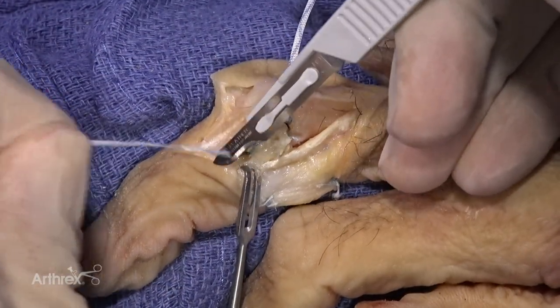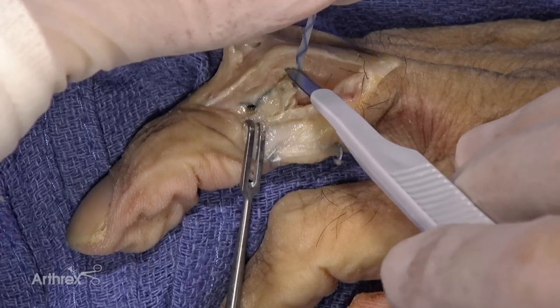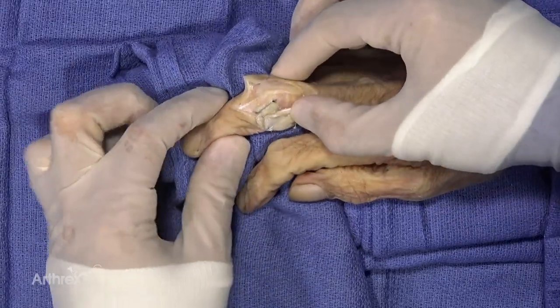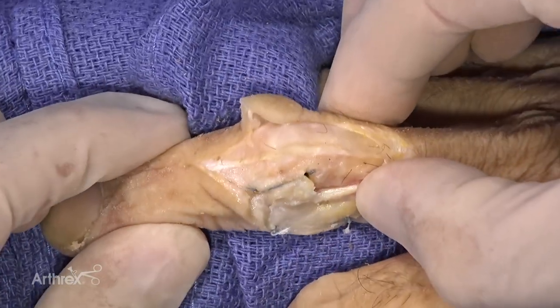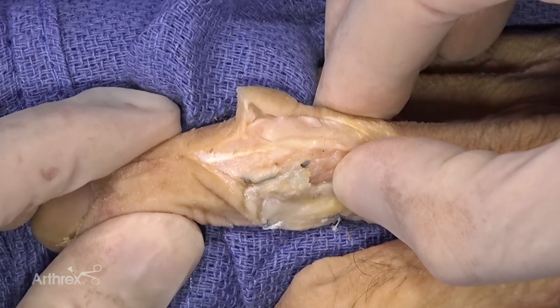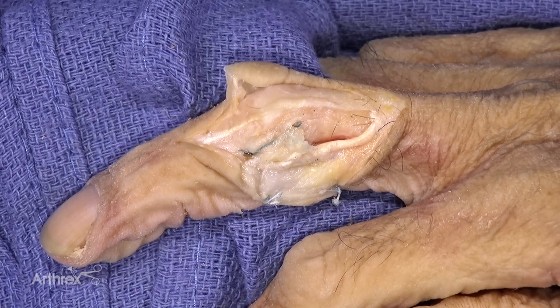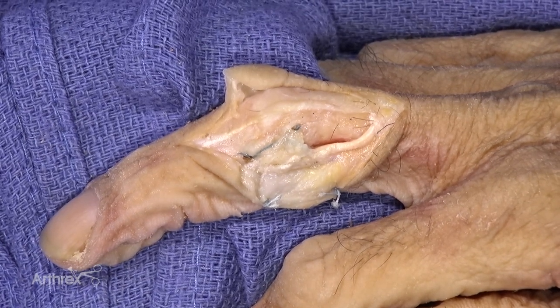You can cut the remainder of that with a blade. And there's your final construct. You can see no more gapping, very strong there, and a nice solid repair. Postoperatively, we try to get them moving pretty quickly, so we try to get range of motion going fairly quickly. I let the wound heal up for about the next 7 to 10 days, and I start general range of motion pretty quickly right after that.